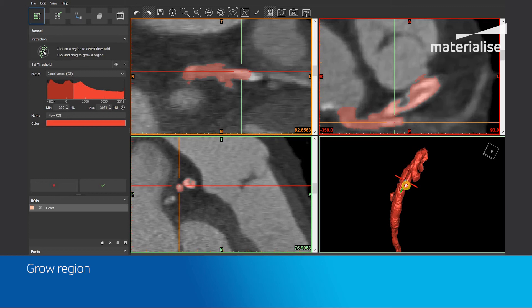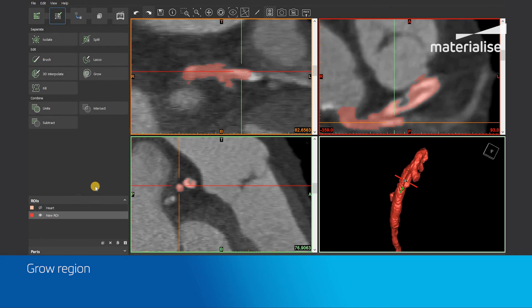When you are satisfied with the result, you can click on the tick mark and apply the operation. A new region of interest is now created and you can continue with your workflow.